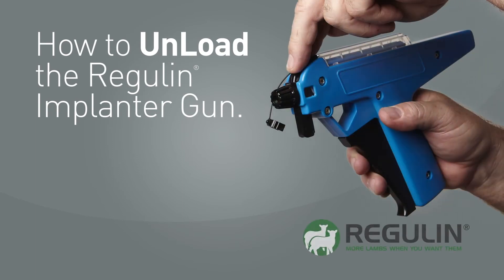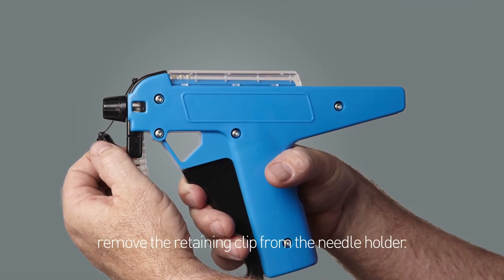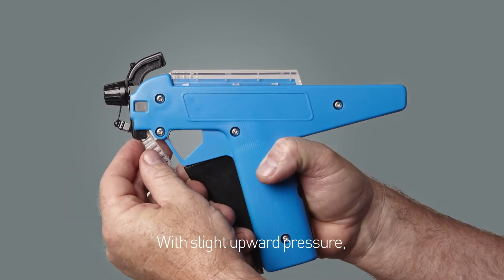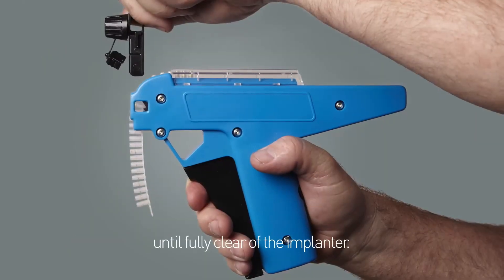Unloading the Regulin Implanter. To remove a half-used implant strip, remove the retaining clip from the needle holder. With slight upward pressure, push the needle holder upwards until fully clear of the implanter.